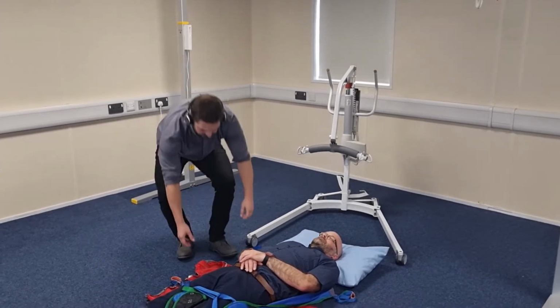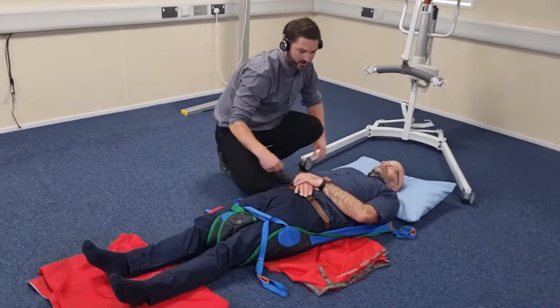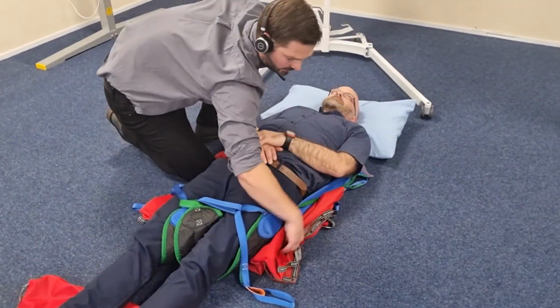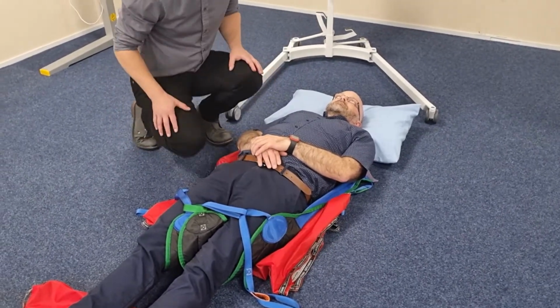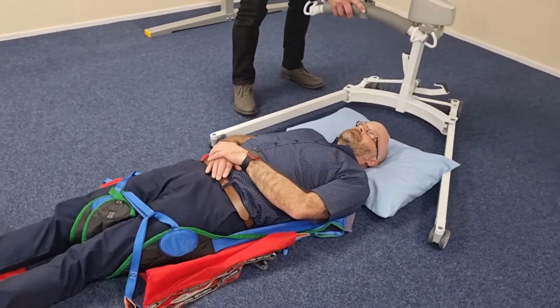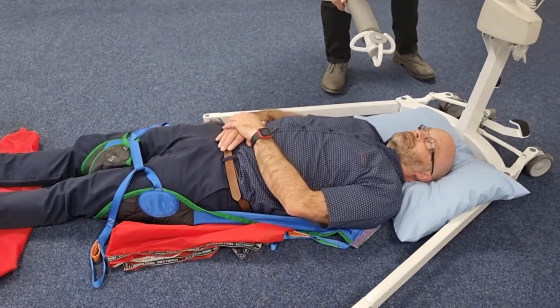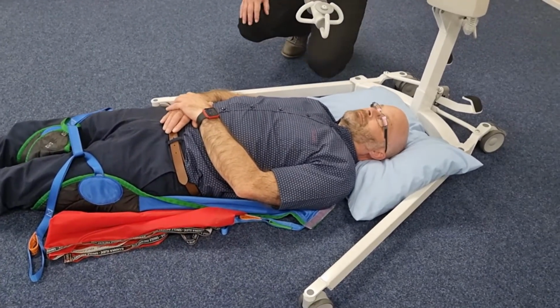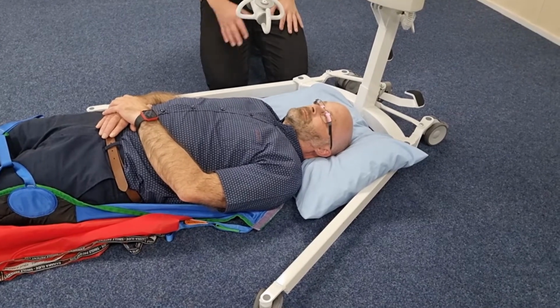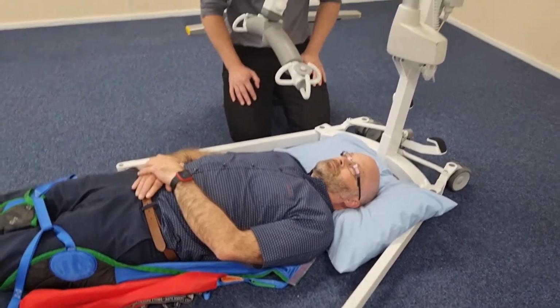What I'm just going to have to do also is tuck the slide sheet and the sling in just so they don't get trapped on the wheels or cause any disruption. There we go. And then I can bring the hoist in. The pillow that is behind the person's head is just providing some protection and comfort as well, but also protection from the metal framework of the mobile hoist.